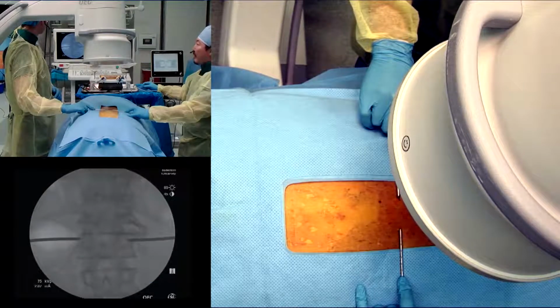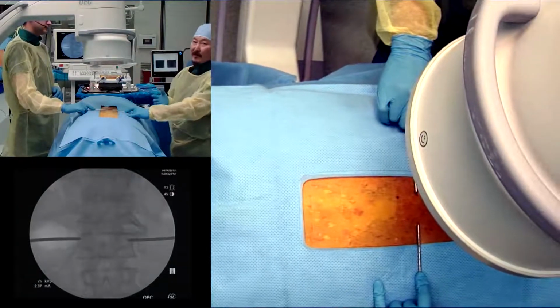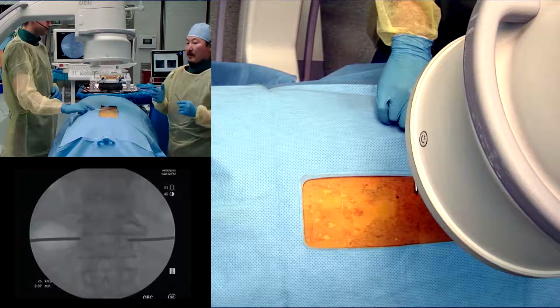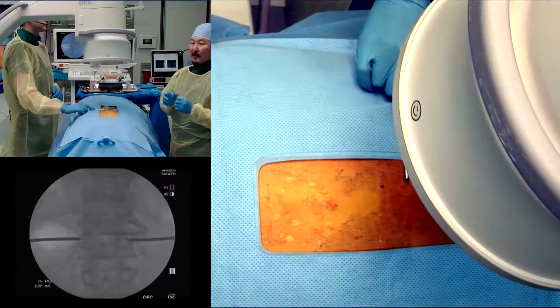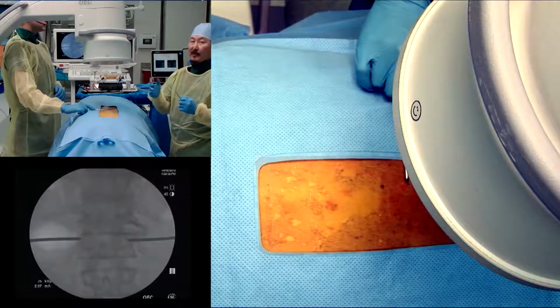kyphoplasty. And where the thoracic spine is different, as you all know, the anatomy is different in the thoracic spine compared to the lumbar spine. The thoracic spine, and it gets more accentuated as you go cranially, is actually longer and narrower rather than wider compared to the lumbar spine.